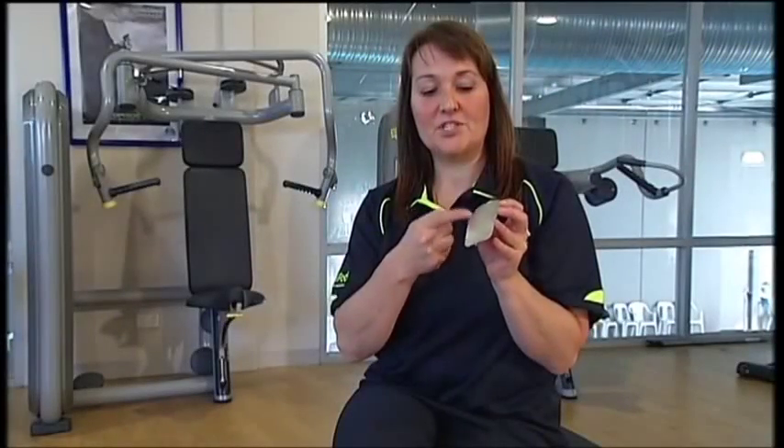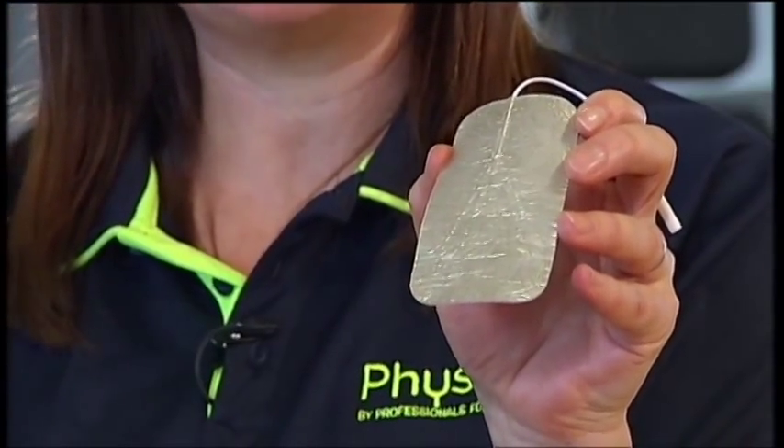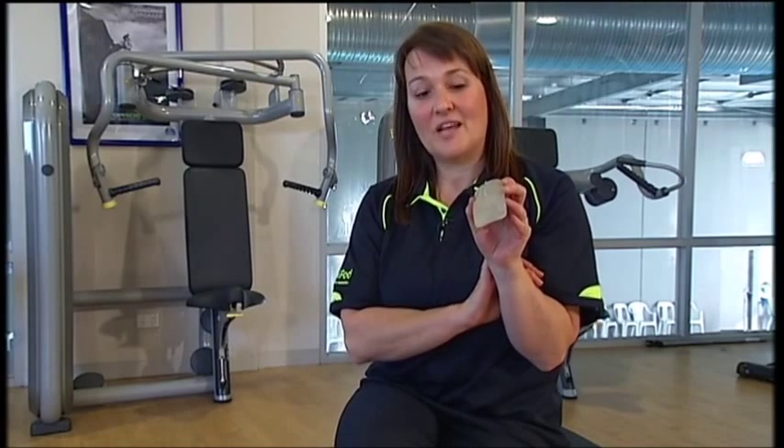If at any time the gel starts to deteriorate, or you can see anything metal through the gel with the leads inserted, then you need to replace your electrodes. How long they last depends on the care of your electrodes and how dry or oily your skin is. If you've got very hairy body parts — really hairy arms or legs — and you're going to be using the TENS often, it might be wise to shave that patch of skin where the electrode will go. This will help the electrode gel adhere to your skin and you'll get a better current flow.